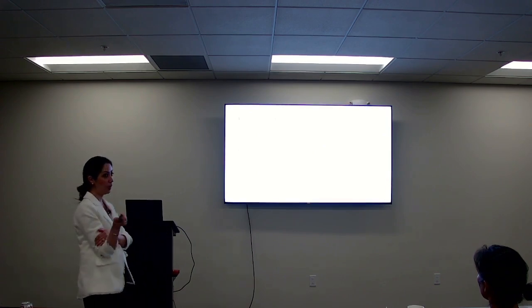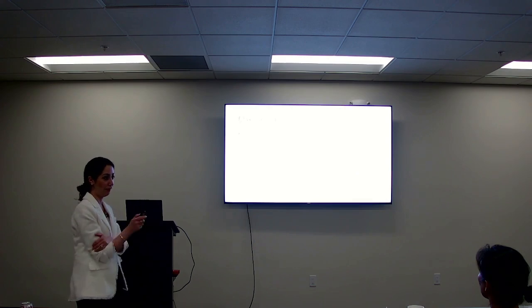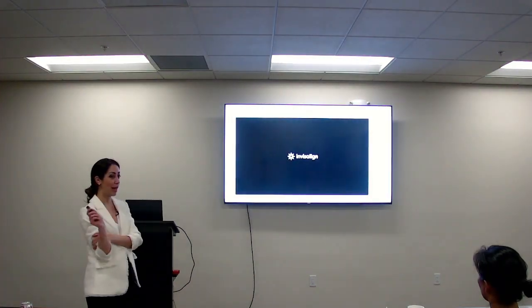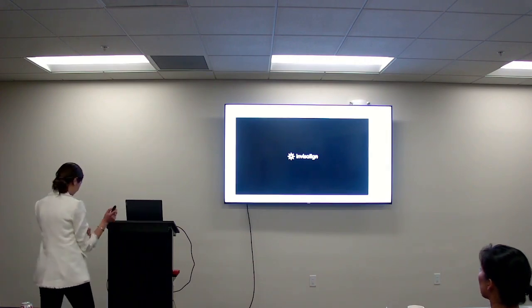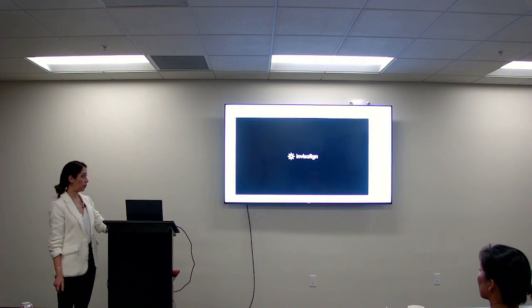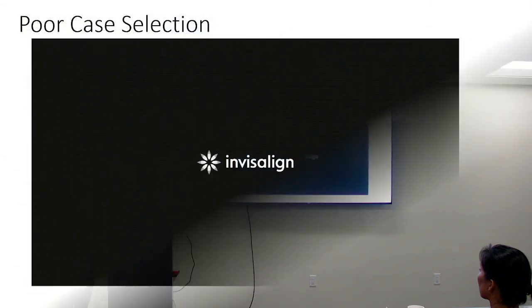By the way, please ask questions anytime you want. You just raise your hand, interrupt me. It's all good. Okay, so this is an example of poor case selection. This is somebody who came to me. They were treated by their dentist, and she said, my bite was off, and my dentist did Invisalign for me, and now my bite's even worse. So it was Express 7.